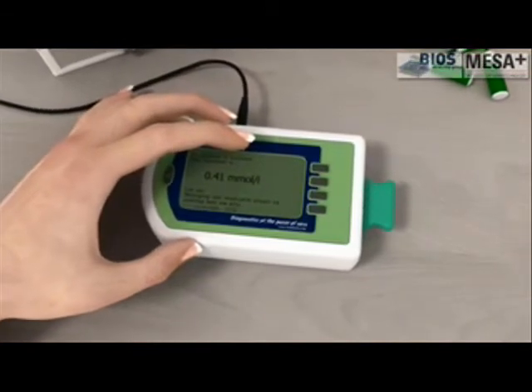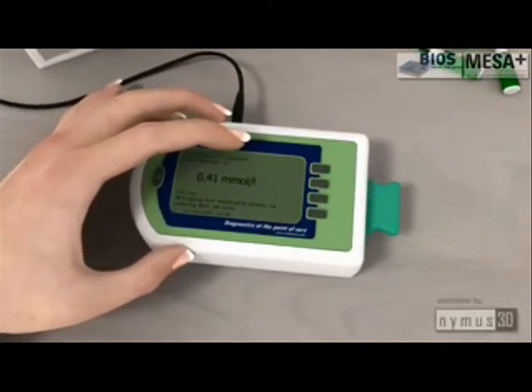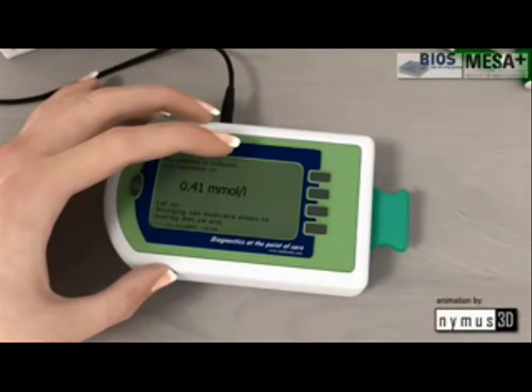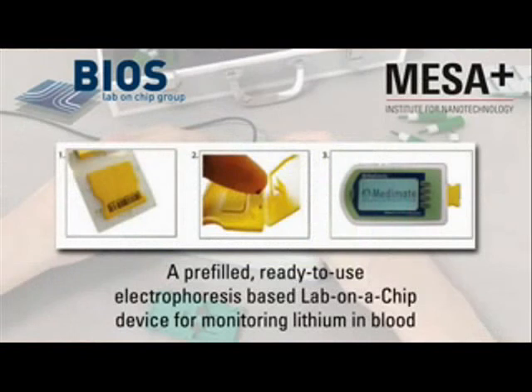A built-in algorithm then calculates the lithium concentration in the blood, which is displayed on the analyzer panel. The chip comes pre-filled and uses closed electrolyte reservoirs, a uniquely new concept specifically aimed at point-of-care applications of electrophoresis.